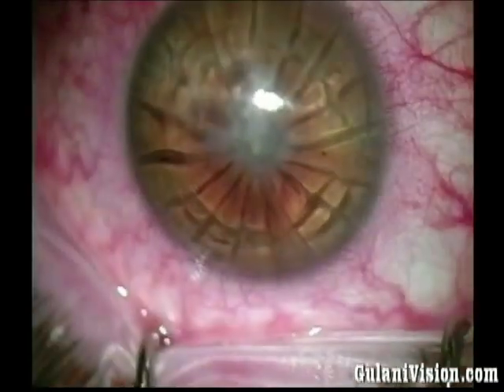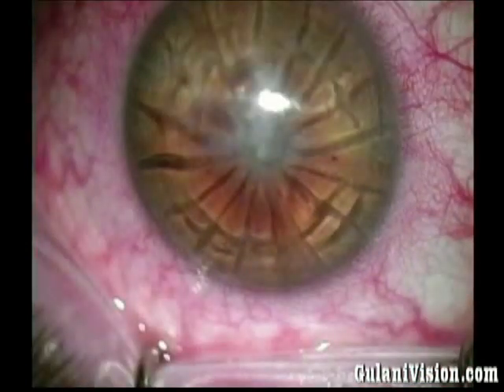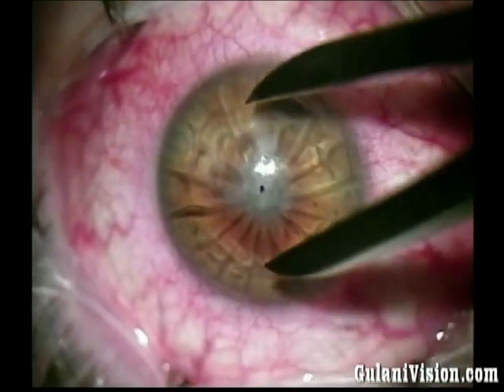This is a case of an 18 incision RK with a dense central scar with ectasia and thinning. Using my corneoplastic principles, I would like to remove the scar and add tissue using a lamellar technique to build this for the future laser ablation. I have another problem here.